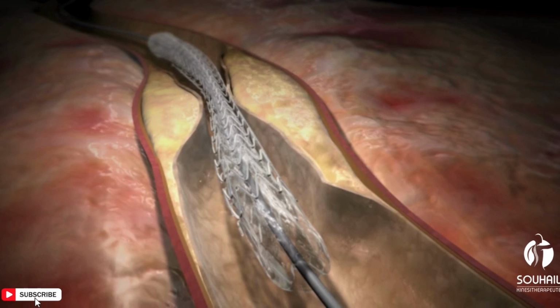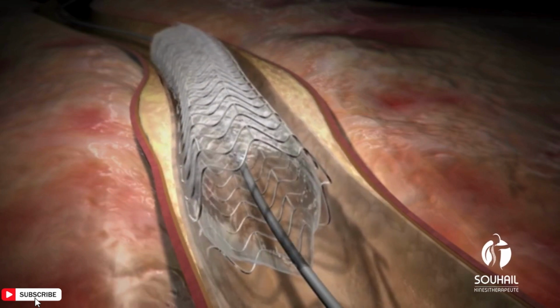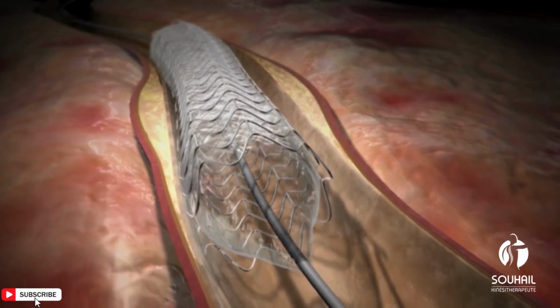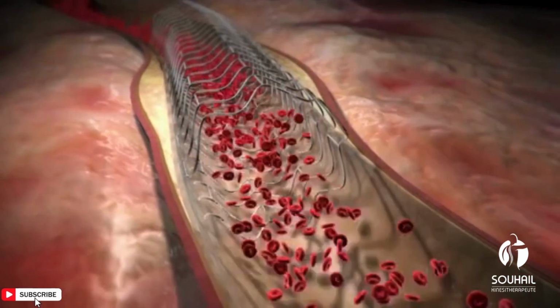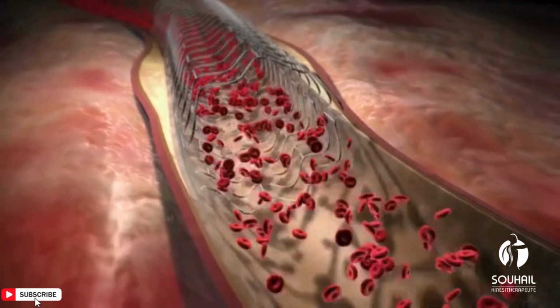Angioplasty is generally considered a safe and effective procedure for improving blood flow in narrowed or blocked arteries, although complications such as bleeding, blood vessel damage, or allergic reactions to contrast dye may occur in some cases. It is often recommended as a less invasive alternative to surgical procedures such as bypass surgery.